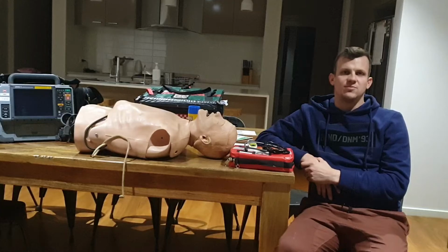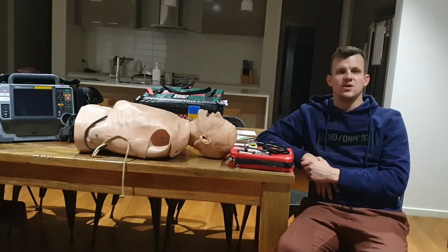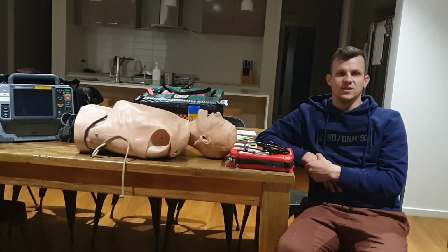Name is Matthew. Today I'm going to be discussing synchronized cardioversion. Synchronized cardioversion is a method used to put the heart back into a normal rhythm in patients with a rapid ventricular rate associated with severely cardiac compromised patients. This may include a decreased level of consciousness, hypotension with a blood pressure below 90, chest pain, and heart failure.